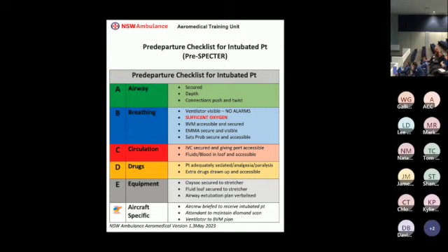Yeah. So there were 5 from the Medumat group that didn't detect a disconnect. There were 2 unicorns, 1 from each group, and they did detect a disconnect, but they did it when they were on the ground. Okay? So essentially, what the purpose of showing you this was that we had a group of 21 clinicians. We were able to identify a lot of disconnects, but out of both groups, this number's too large. Right?